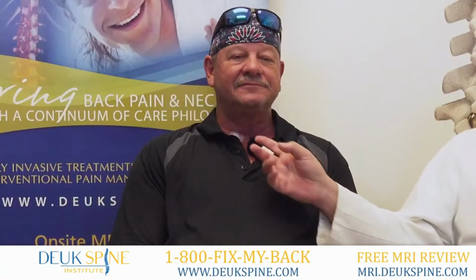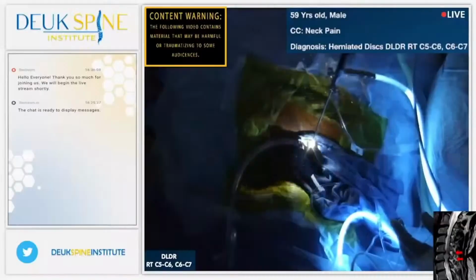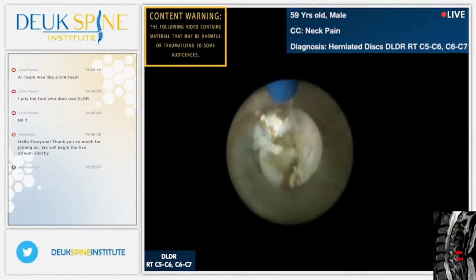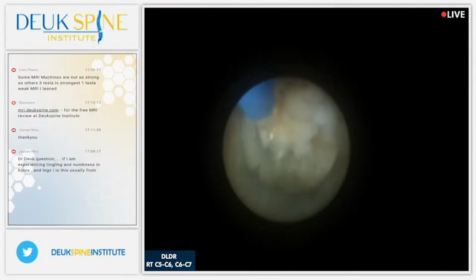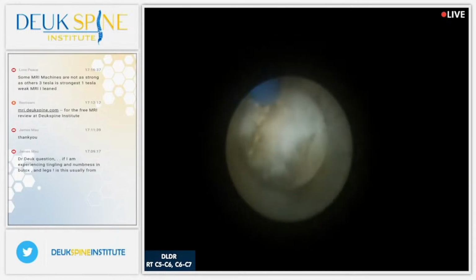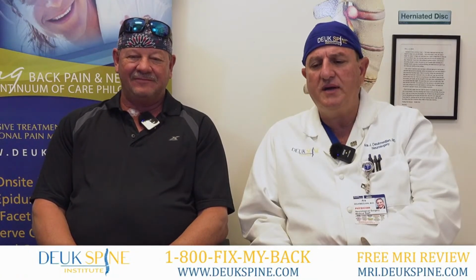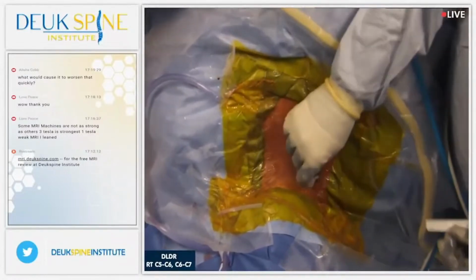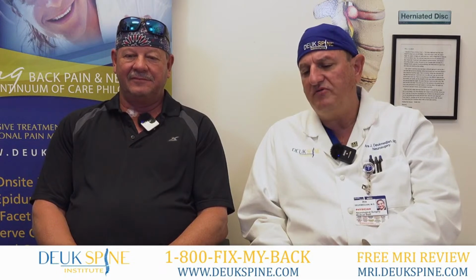And you can see your tiny little incision right there. It's a 4 millimeter. You can see we went in with a little tube into your disc. I was able to get both discs fixed. You had a lot of herniations in there. Something a lot of people don't understand: they think that a herniation is one piece, but it's about 30 pieces on average. And you had about 30 pieces in each of your discs. They were hard to get to, but we got it done. And I was very happy with the end results. We got all the pressure off the nerves and we fixed the tear in the back of the disc. Less than 24 hours, here you are.